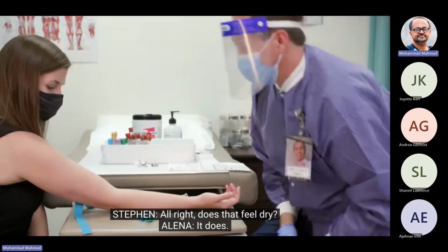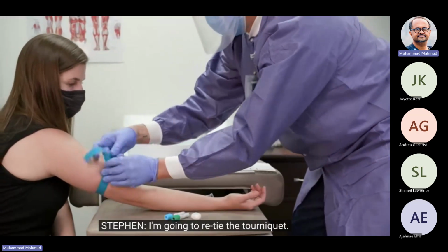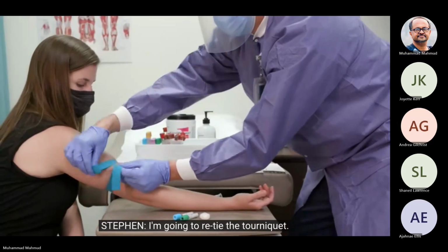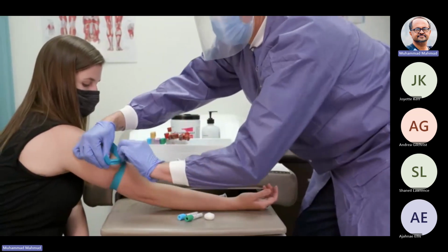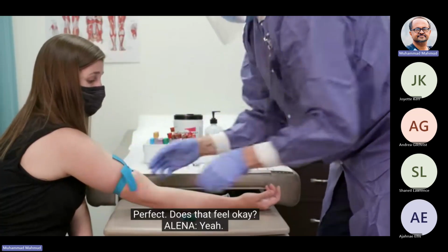All right, does that feel dry? It does. Okay. Retie the tourniquet. Okay. Perfect. Does that feel okay? Yeah. Okay.